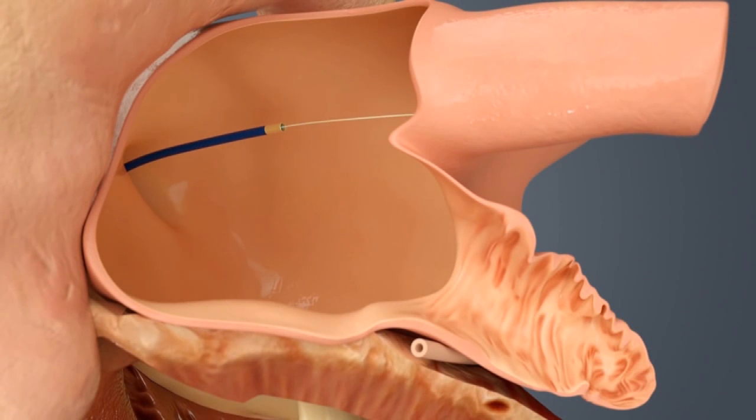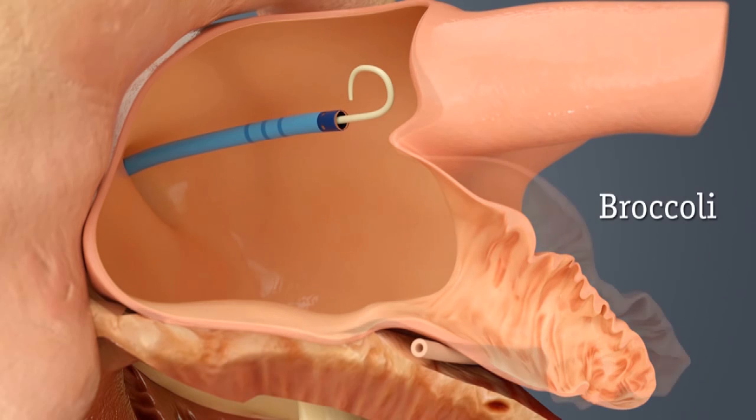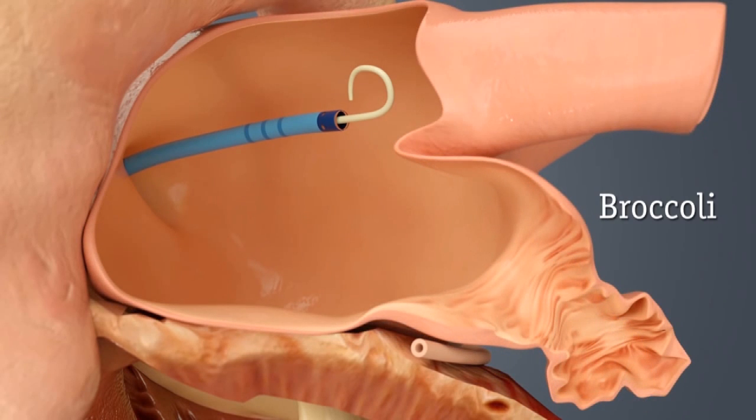At this point, we push the catheter and our wire into what is called the pulmonary vein, which is a good landing zone for this relatively large catheter. As you can see, the appendage lies below the pulmonary vein. There are different types of appendages, which is very important to us as we attempt to determine what size device to use.